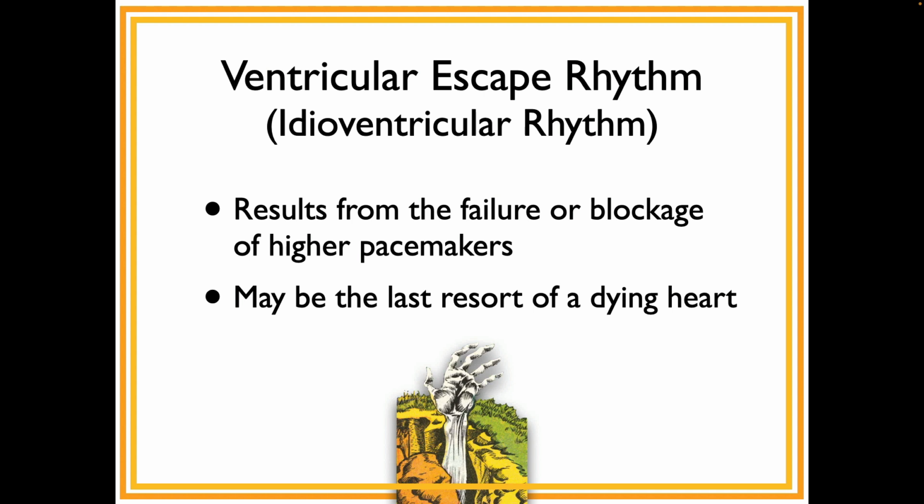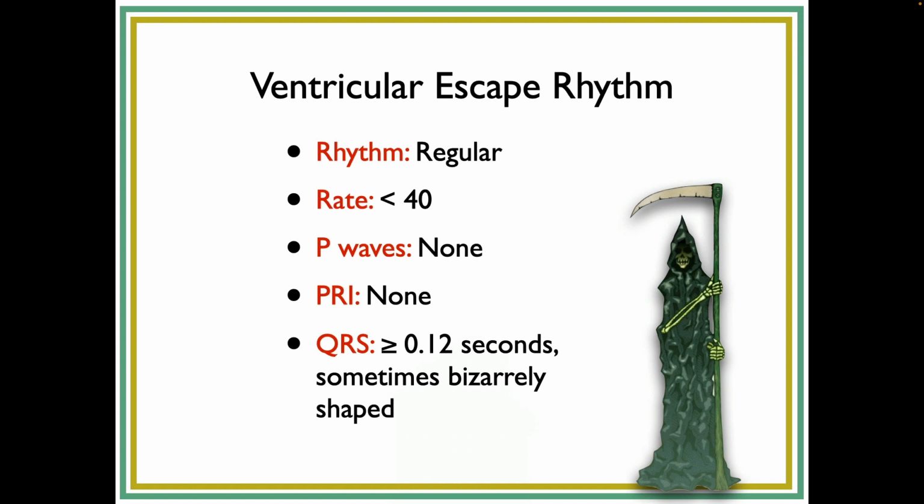And so ventricular escape, remember when we talked about what happens if the faster pacemaker dies, if the SA node goes on vacation and the AV node follows suit, the ventricles will take over pacing themselves, and that's what ventricular escape is, okay? You're not likely to see much ventricular escape. It's not a very common rhythm. In a minute we'll talk about why.